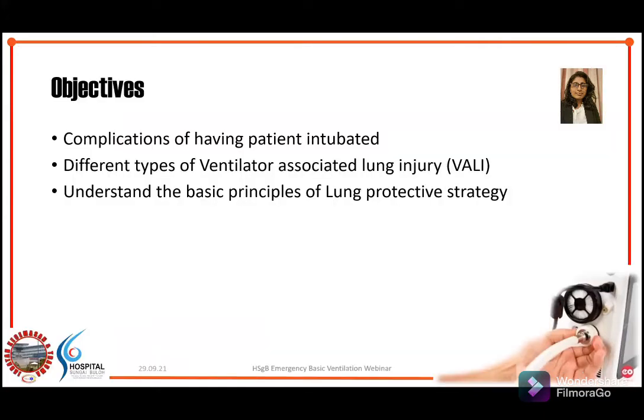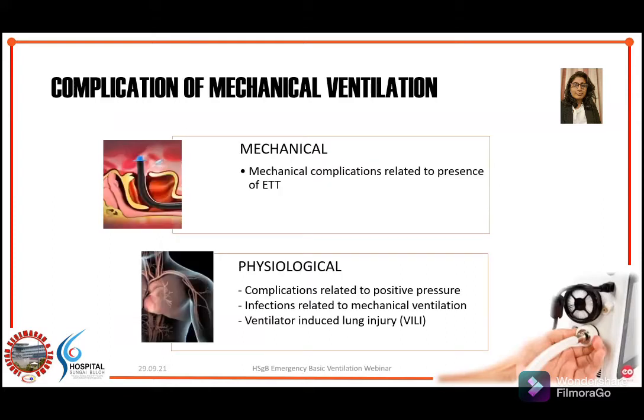So the objective of my presentation, I would be talking on complication of having patient intubated, different types of ventilator-associated lung injury, and understanding the basic principles of lung protective strategy. So first off, let's look at the complication of having patient mechanically ventilated. So I've divided it into two categories, which is mechanical and physiological.